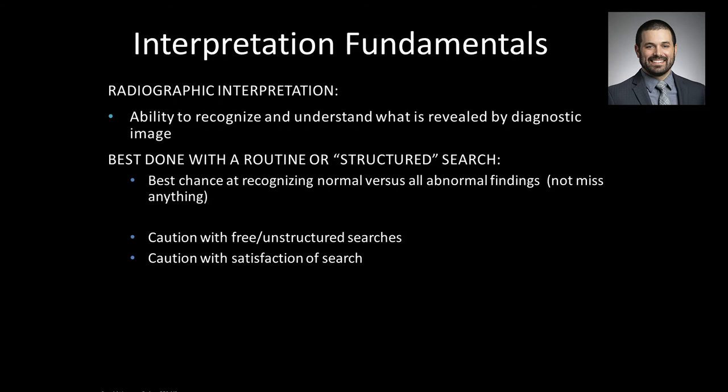The other way satisfaction of search can show up is if you open up a scan and you find a surprise or incidental finding that's really interesting, and you're completely engrossed and fascinated by this surprise finding. It might be a cyst, it might be a tumor, could be anything. You're satisfied then in that you found something interesting, but you forgot to complete that entire top to bottom, front to back, side to side search of the entire scan volume. And you maybe missed the additional piece of pathology on the other side of the patient, for example.